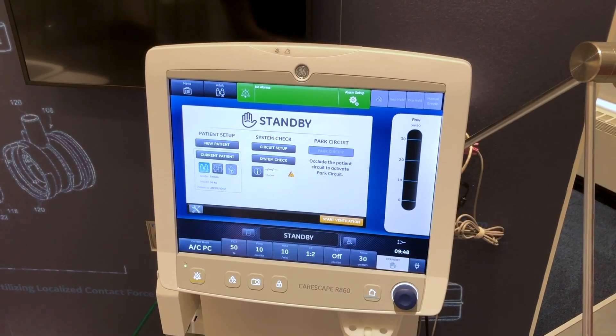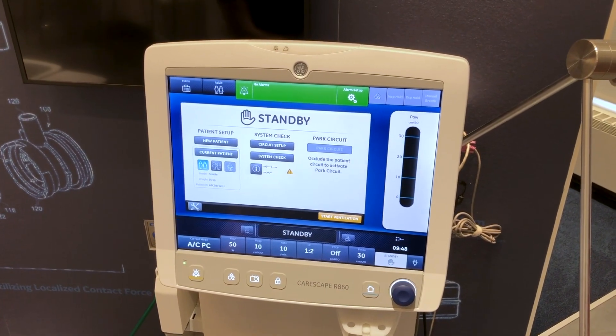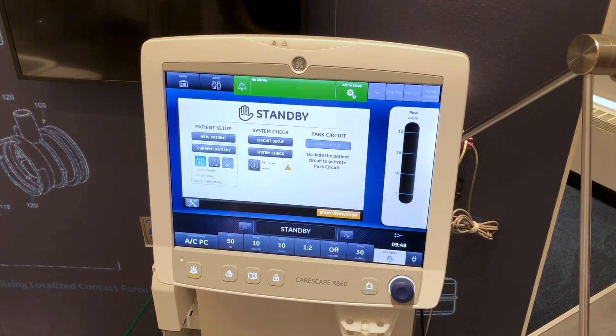In this video you will learn how to complete the patient setup on the CareScape R860.